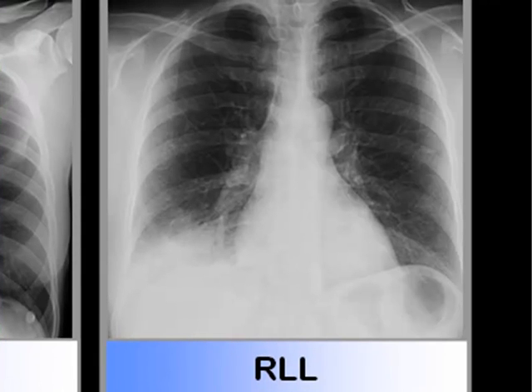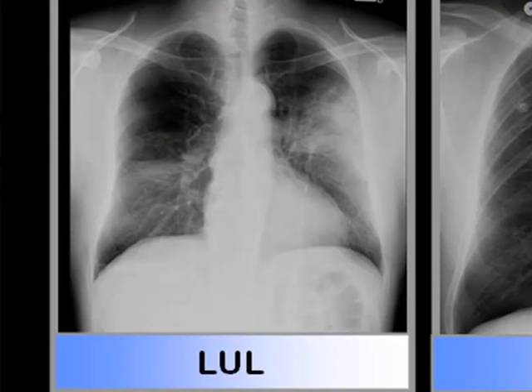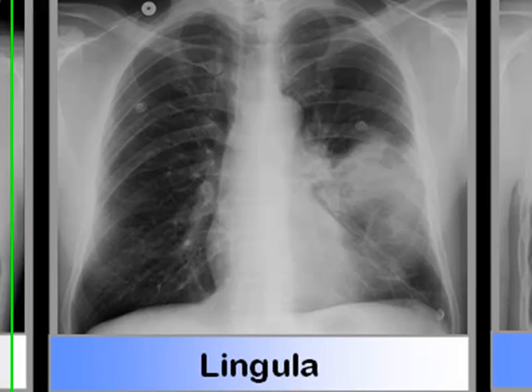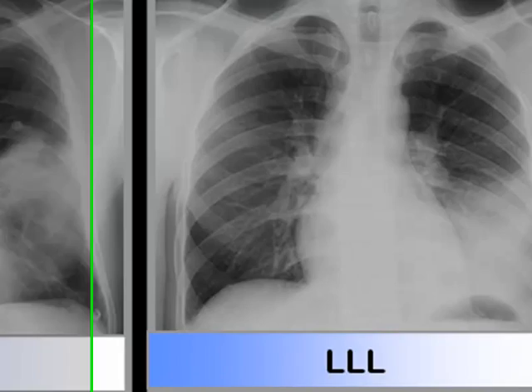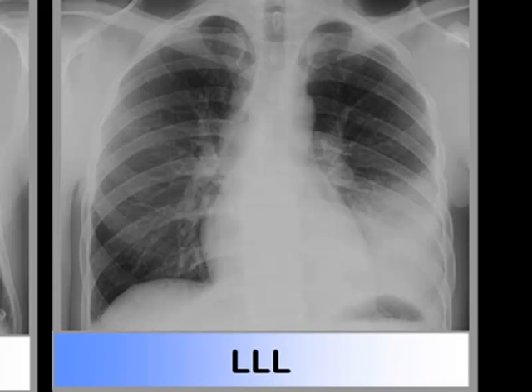This is the appearance of pneumonia in the right lower lobe, which silhouettes or obscures the right hemidiaphragm. This is the appearance of pneumonia in the left upper lobe. This is pneumonia in the lingula, the analog to the right middle lobe, which obscures the left heart border. And this is left lower lobe pneumonia, in which the heart border is retained but there is silhouetting of the left hemidiaphragm.